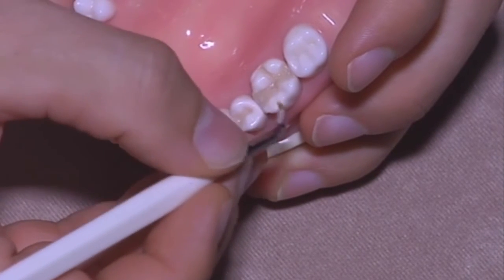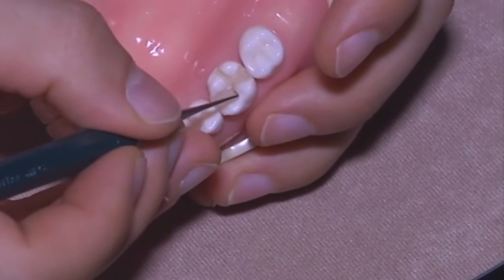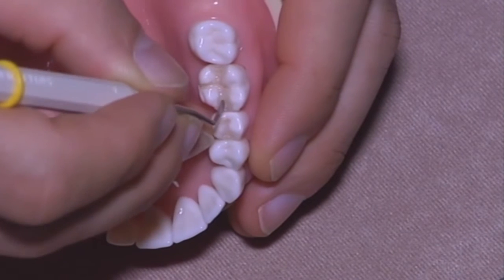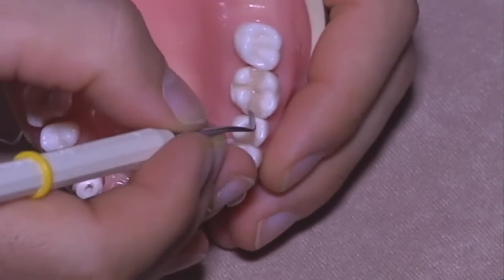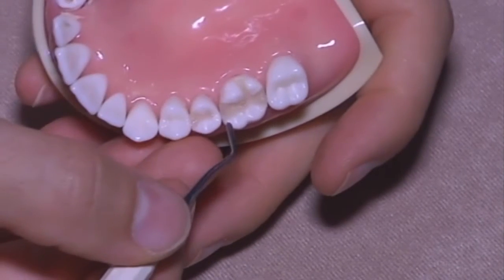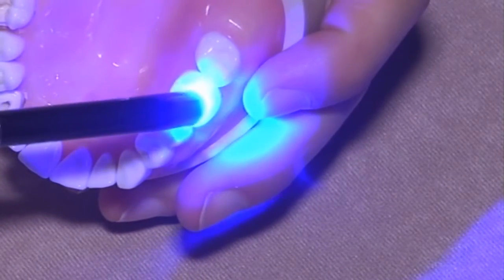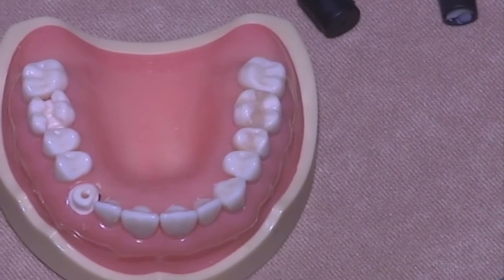Okay. And just find back the initial sulcus I performed in dentin, in order to have the correct shape even of this part. Last two layers.